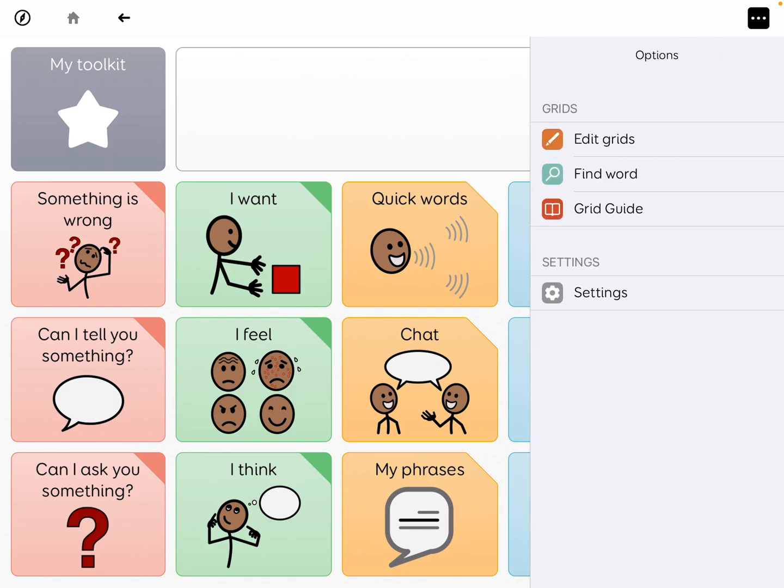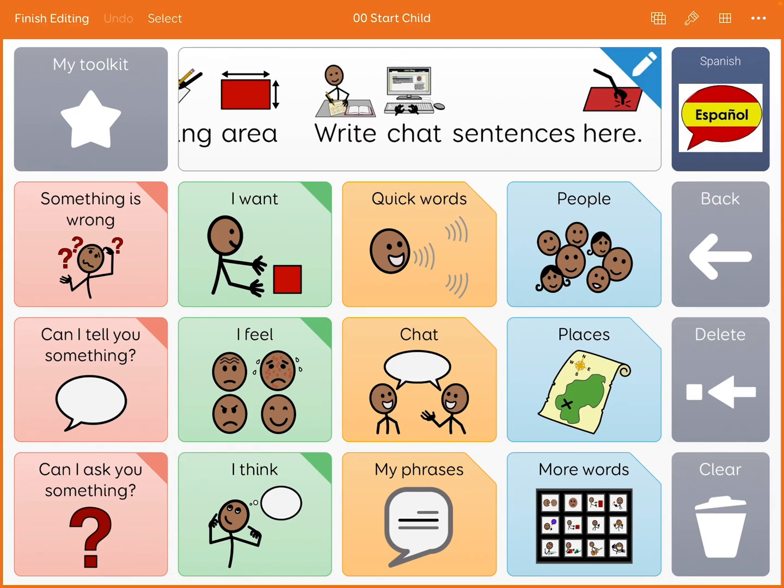So instead, I went into Edit Mode. Because the message window here is pretty large on VocoChat, I thought there might be some room I could use. Right here at the top right-hand corner where you see that I've added Spanish — that is a button that, if you're on a device capable of using eye gaze, would be your eye gaze rest button. My iPad doesn't have eye gaze, and none of the individuals I've supported on an iPad with Grid for iPad are using eye gaze.